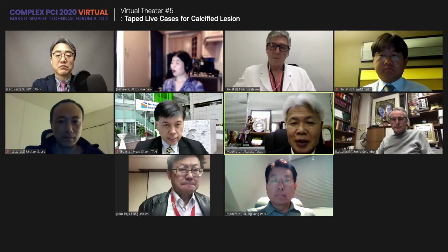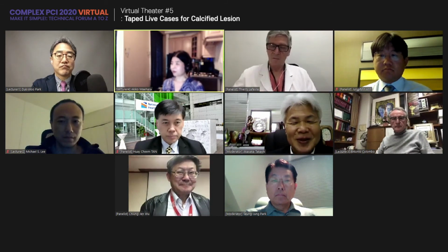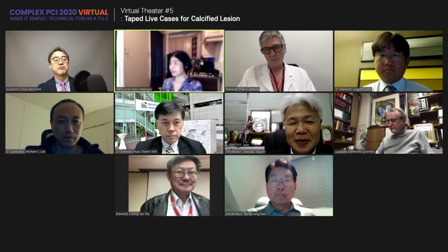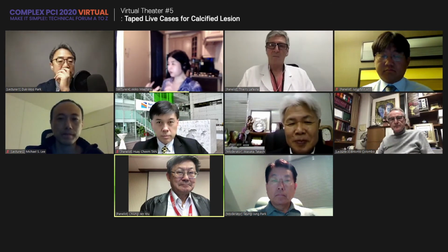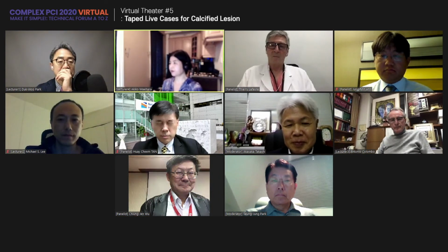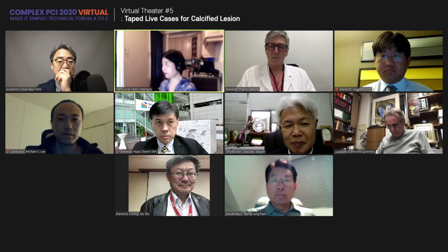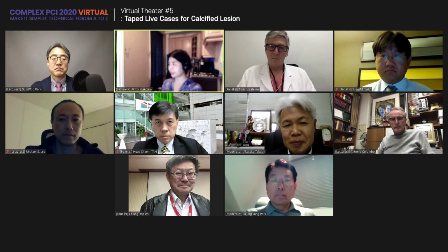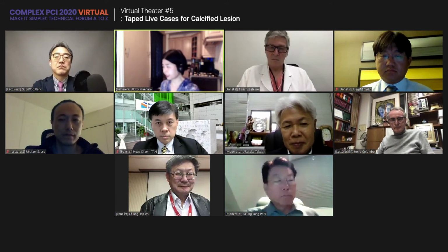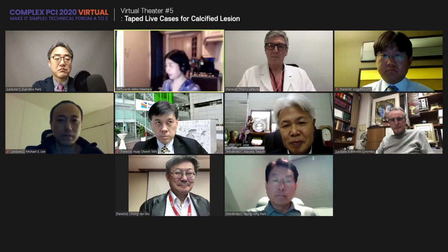Akiko or others? But let me start by myself. I think that's very important. Even though we are saying the total amount of calcium is causing the under-expansion, there is another cohort, which I call the malignant calcium, which is not super big, but typically very thick and eccentric with negative remodeling, and typically in the mid LAD.